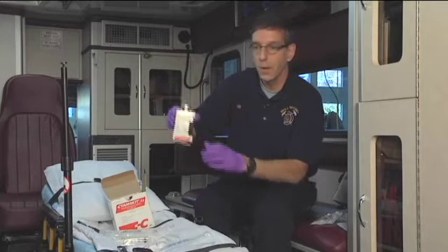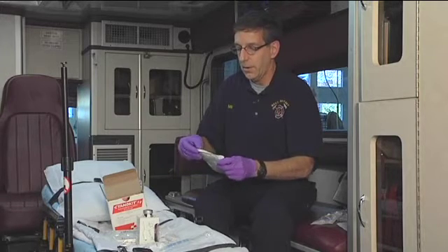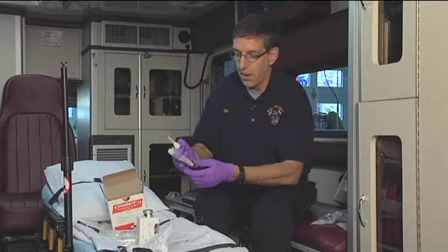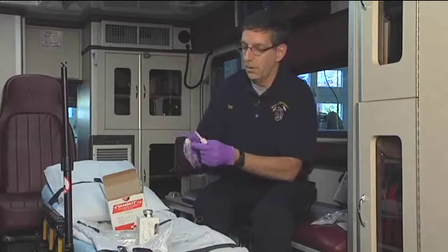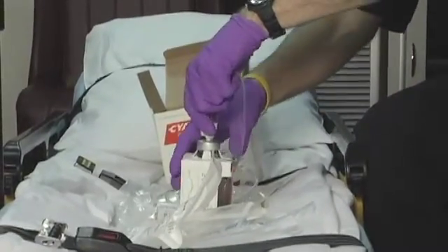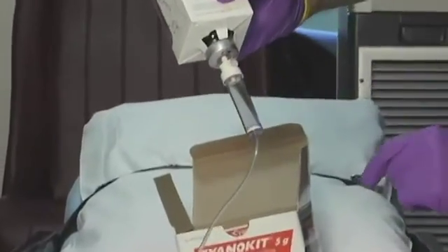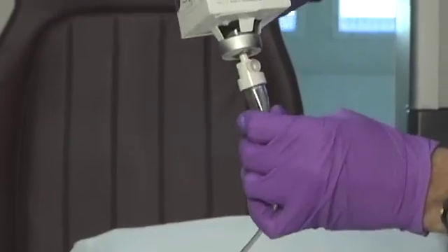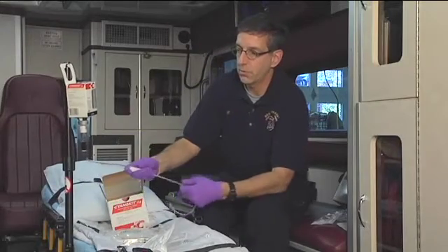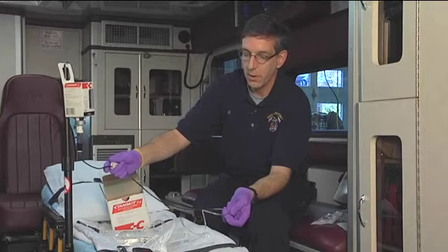The next thing is to attach the intravenous set. Inside the Cyanokit is a drip set that can be used with the bottle. We'll open up the drip set and spike the bottle just as we would any IV solution. Note that the bottle has a vent that allows air to move in so that fluid will flow. We'll spike the tubing, hang it on an IV pole, and run the solution through the tubing to get it ready to administer. Notice the dark red color of the mixture.